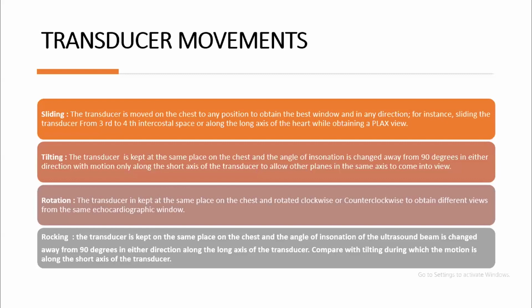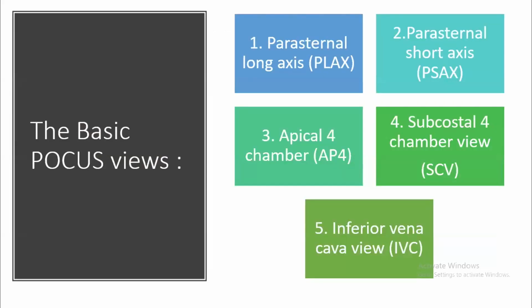This is only terminology, but what is important for us is the basic POCUS views. As we said, we are not talking about cardiology or echocardiography. We are talking about POCUS, which is rapid assessment of the function of the heart and volume status.